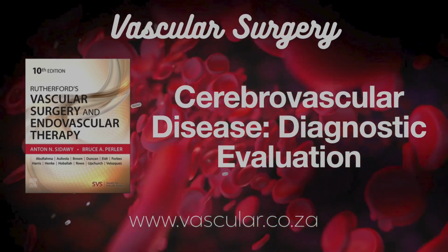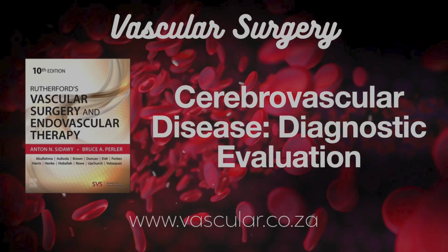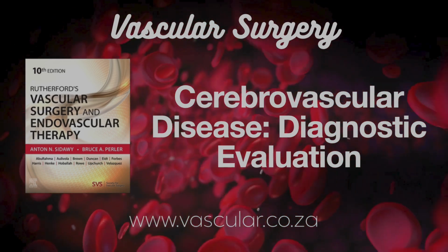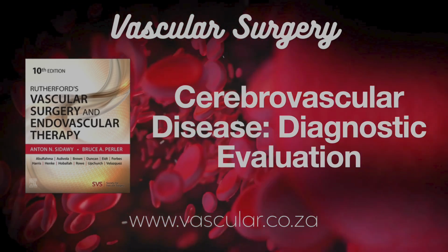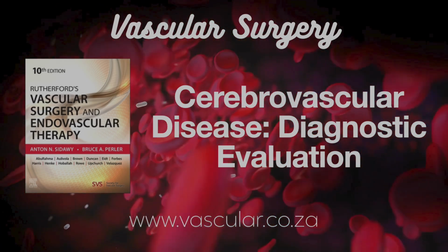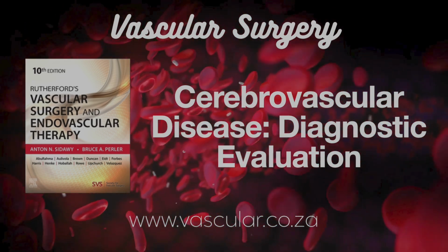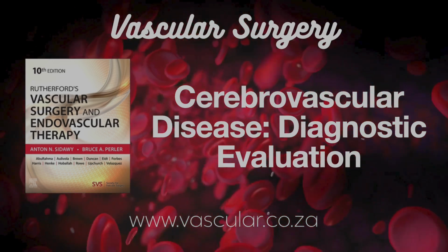Yes. If you find a problem during the DSA, like a clot causing an acute stroke, or bleeding from an injury, you can often treat it right then and there through the same catheter, maybe using clot-busting drugs, balloons, coils, or stents. That dual capability is huge in emergencies. Diagnostic and therapeutic. That makes sense for specific acute situations. But being invasive, what are the risks?